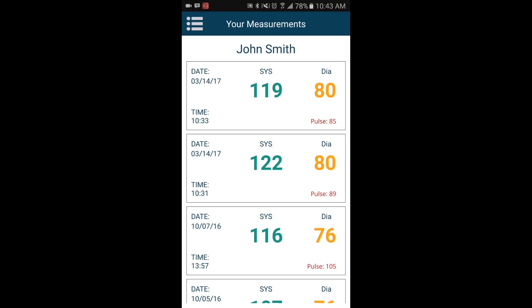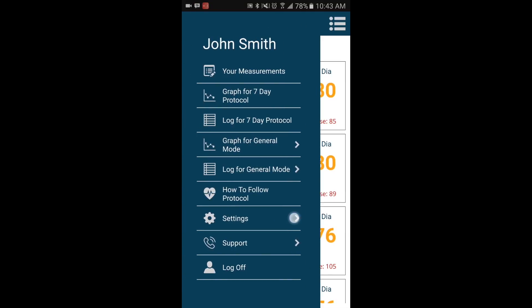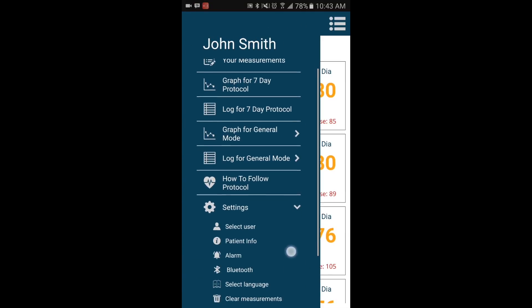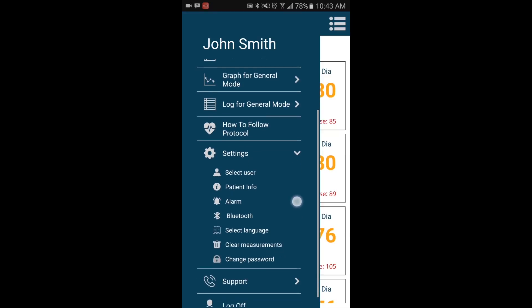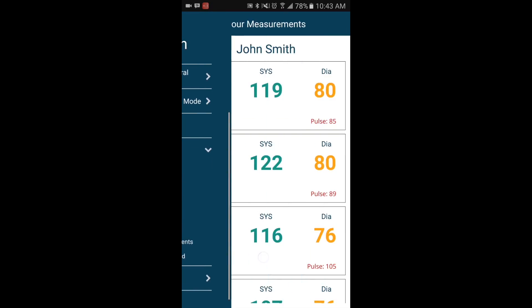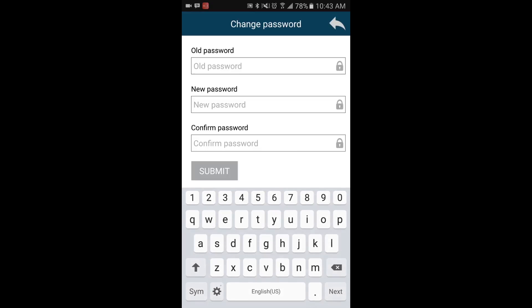If you would like to change your password, you can go into Settings and select Change Password. You can now choose a different password for your account.